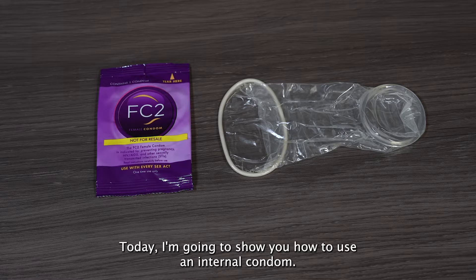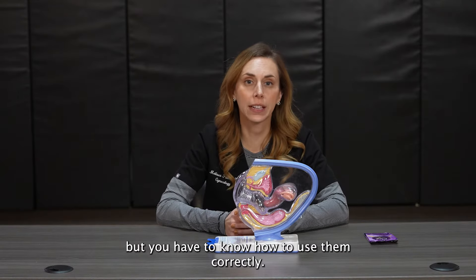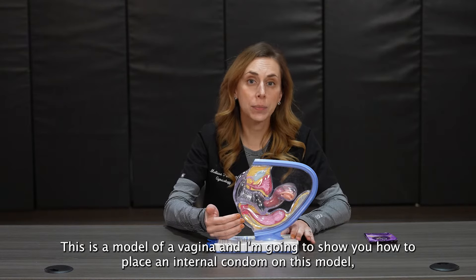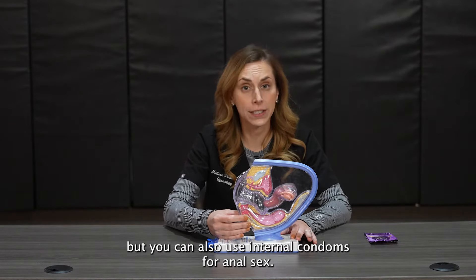Today I'm going to show you how to use an internal condom. Condoms are used to prevent pregnancy and sexually transmitted infections, but you have to know how to use them correctly. This is a model of a vagina and I'm going to show you how to place an internal condom on this model, but you can also use internal condoms for anal sex.